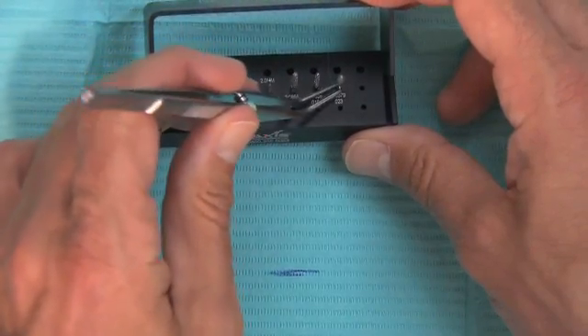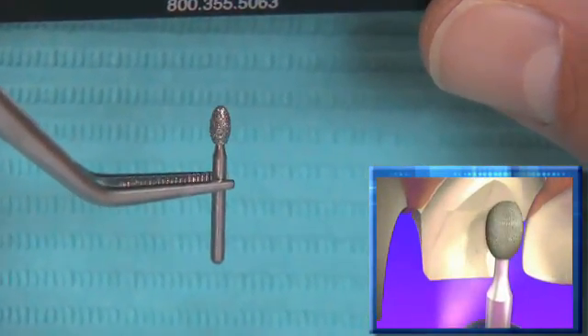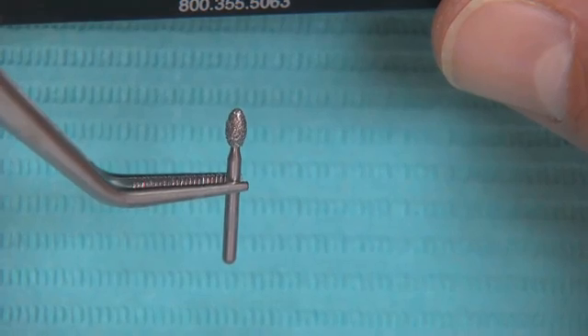The last thing we need to do is lingual reduction using the 379023 football diamond, again in super coarse grit. I prefer super coarse burrs because by virtue of removing more tooth structure, they create less frictional heat and allow us to prep more efficiently.